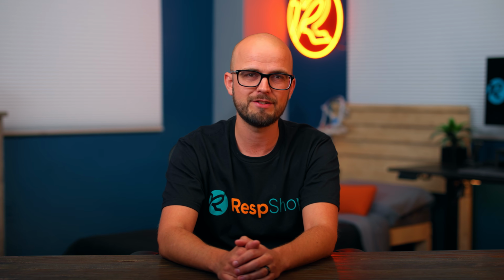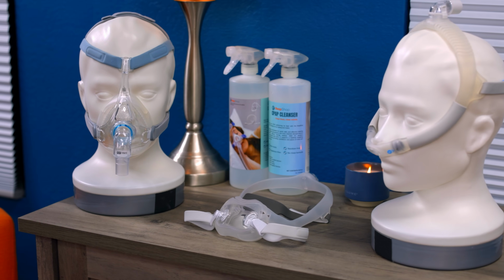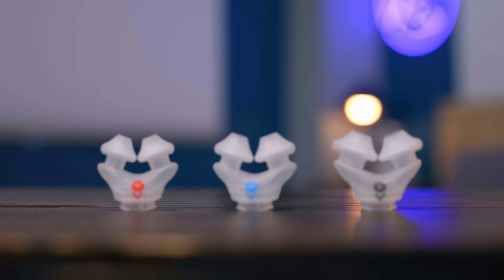Having given you guys some great hacks to try if you have a non-standard face, you'll have noticed that I sometimes talked about finding the right mask. Most mask types can come in different headgear sizes and cushion sizes, so make sure that you get the right ones, whatever mask that you do buy.